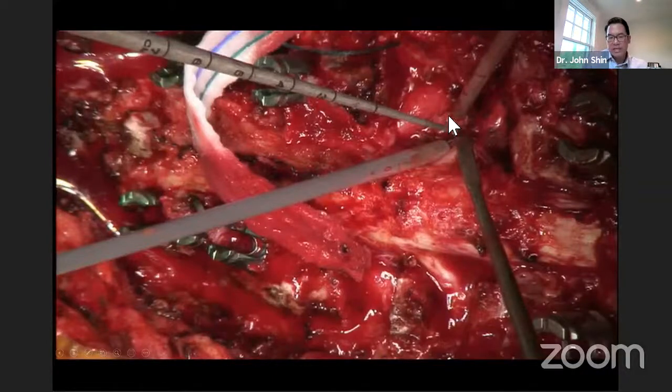One of my earliest cases. This is a C7 PSO. So C7 nerve root, you can see here, C8 nerve root here, Penfield 4, just gently mobilizing the shoulder of that C8 nerve root.